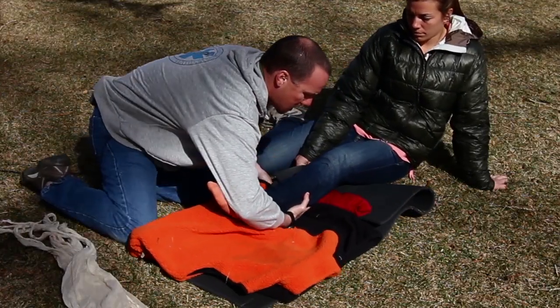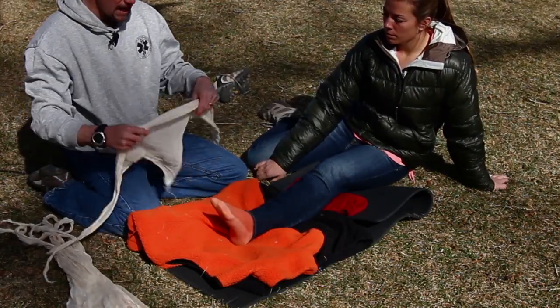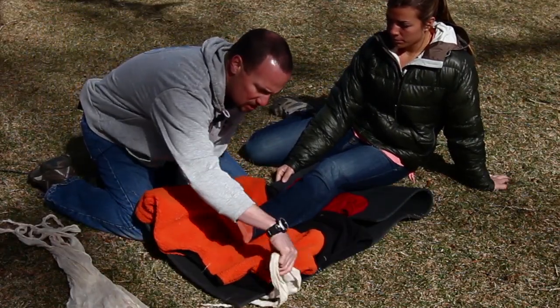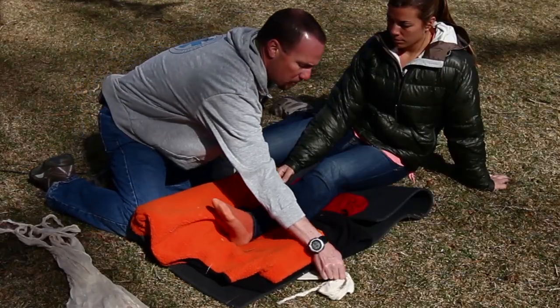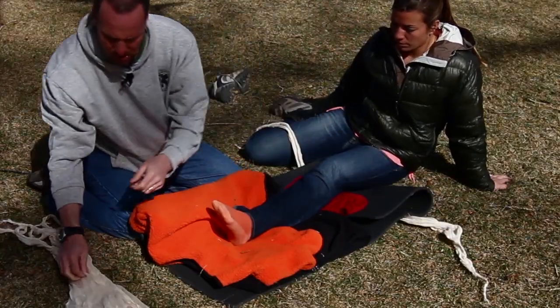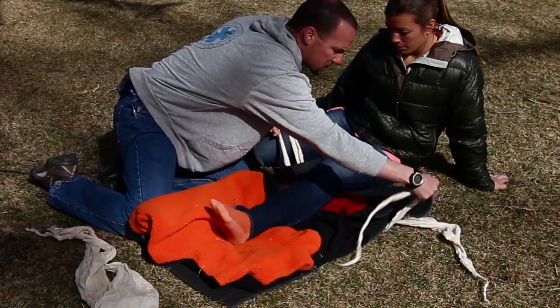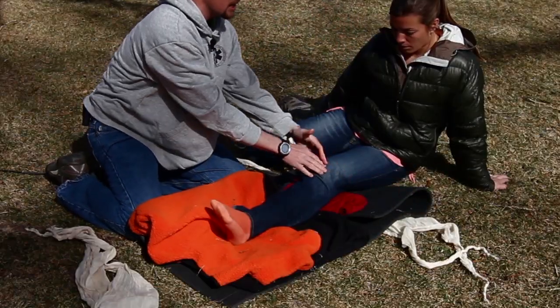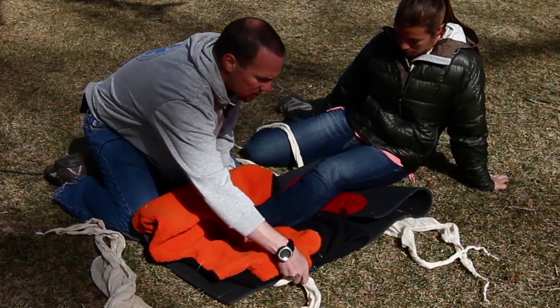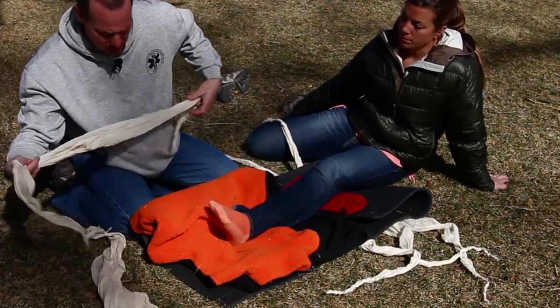I'm going to take some cravats to tie my splint into place, and I'm going to think about ways to move my cravats up without having to manipulate my patient's leg. I can slide them up and get them into position. I'd like to have at least two securing points above Jordan's knee, and if I had a patient with particularly long legs, I might need three or more. I'm going to have at least two securing points beneath Jordan's knee, but I'm going to try not to tie anything directly over her knee as that would probably be uncomfortable.